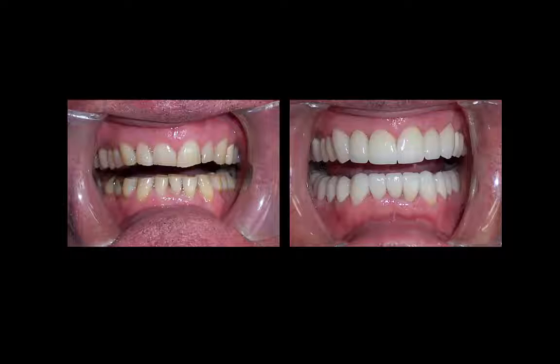We also have a photo book of different possible smiles. So before we started, we decided what type of smile this gentleman would like to have. We made temporaries after the preparation visit that were very similar to the end product. This gentleman wore these temporaries for about three weeks and commented during that time what he liked and what he didn't like, so we could come up with the finished cosmetic result that he was happy with.